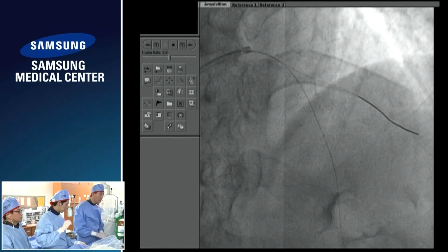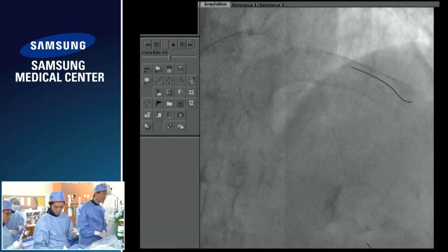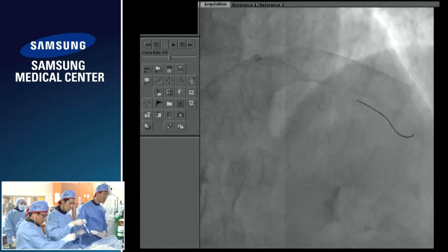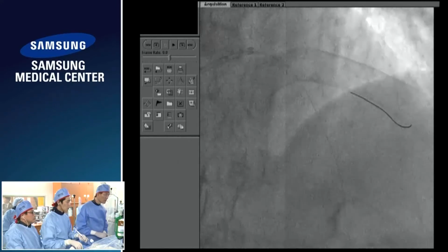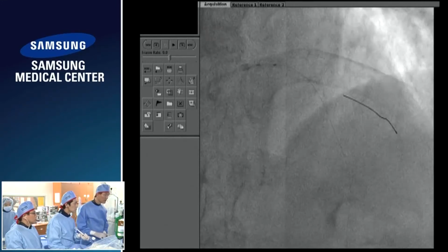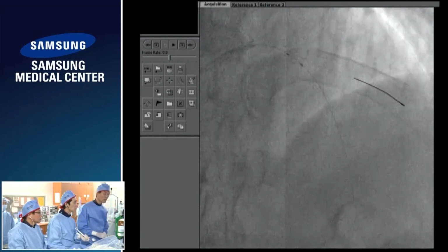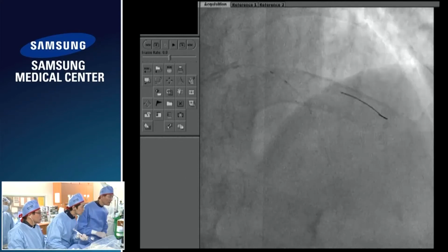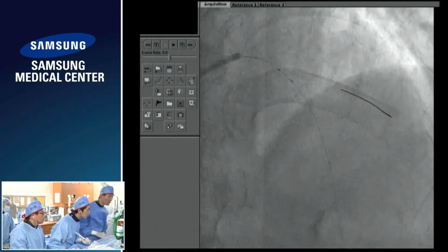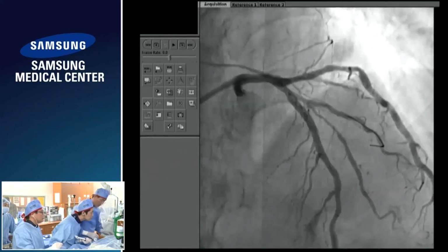Anyway, by the book, by the paper, actually the location of the final POT is very important. So just covering the carina, that's the beauty. So angiogram. Sure. Oh no, too distal.